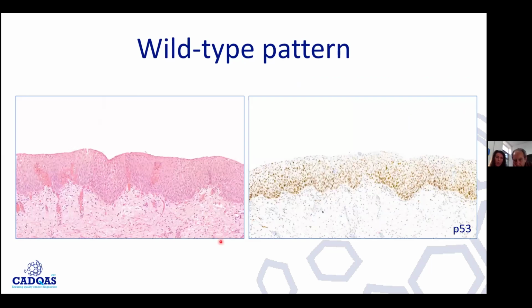So this is a little bit more excited, very busy epithelium. This is a bladder, and we can argue that this could be hyperplastic. But then this was inflamed as well. And I think this patient had radiation after, I think just for another reason in the pelvis. But you see again the same gradient. So maybe here the proportion of staining nuclei is much higher. But again, the staining intensity is at most moderate to strong.